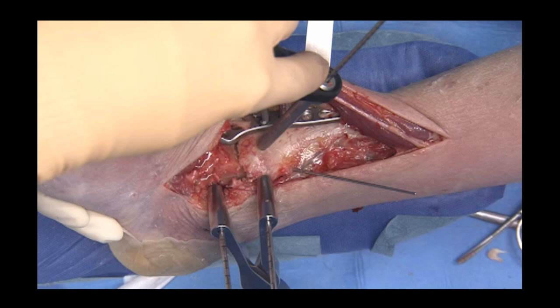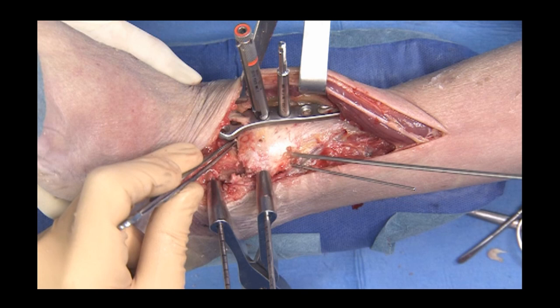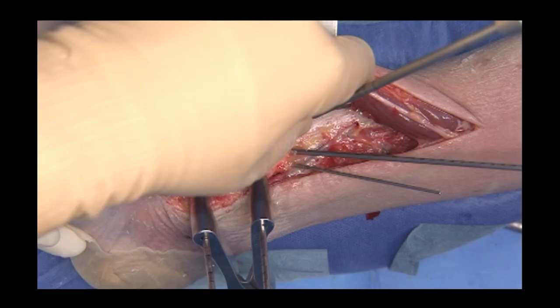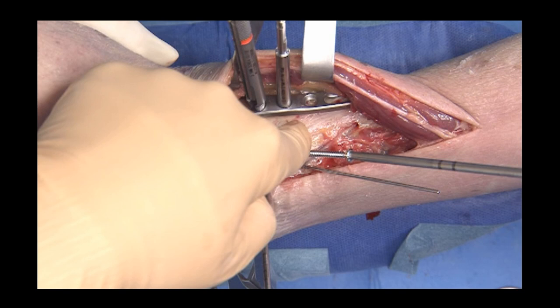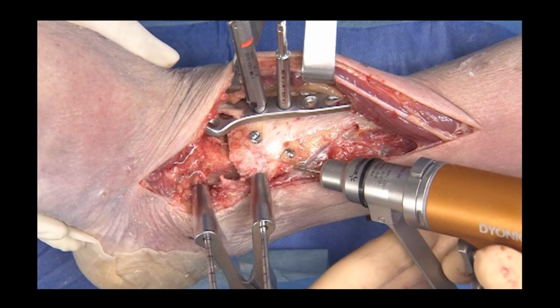3.5 mm lag screws are positioned on either aspect of the ankle depending on the pre-op deformity. If it is a varus equinus deformity, as in this case, the anterolateral screws are positioned first. K-wire and threaded pins are removed.